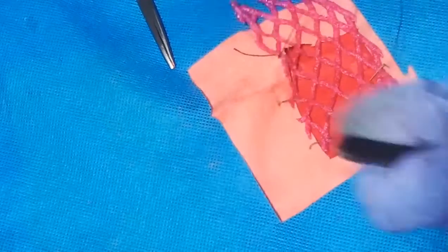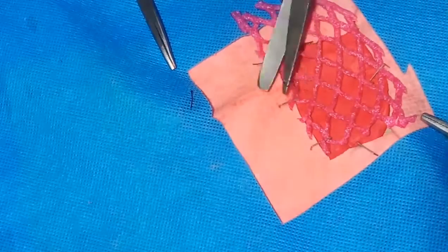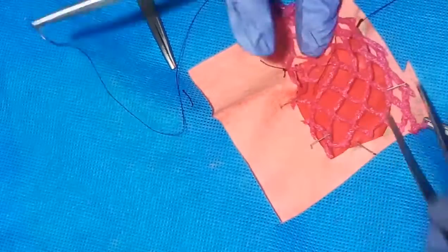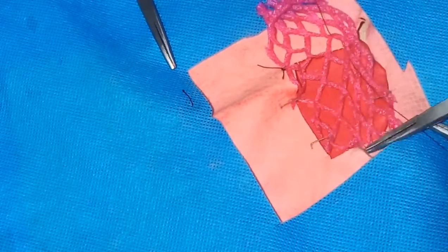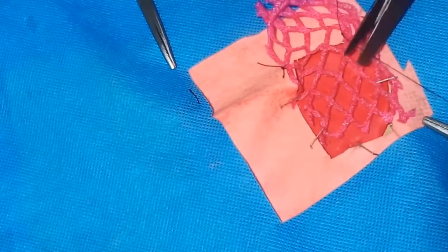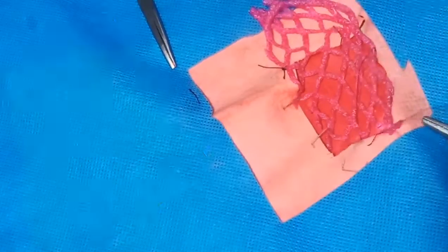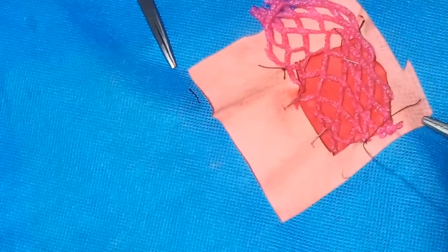To ensure an open mesh on the graft for wound drainage, a 2 to 3 millimeter margin of skin is trimmed from the free graft edge before it is sutured or stapled to the remaining wound edge. After edges are sutured, the graft is further secured by placing simple interrupted sutures between the slits in the graft at strategic points where contact is not firm or motion is likely to occur. Additional sutures are spaced throughout the graft field but not through all adjacent slits.